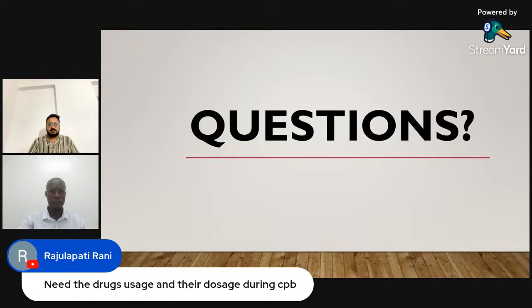Okay, do you add FFP, fresh frozen plasma, in the prime? We don't add FFPs at our center. I was discussing with someone in the US. He was saying in their center they use FFPs in prime, but for us we don't.